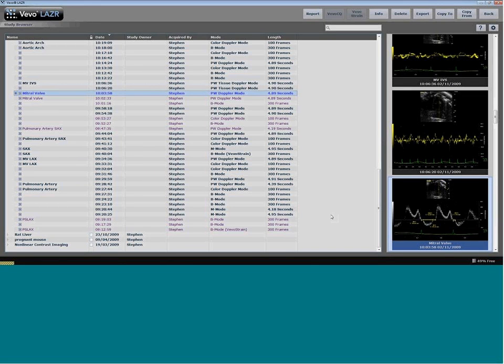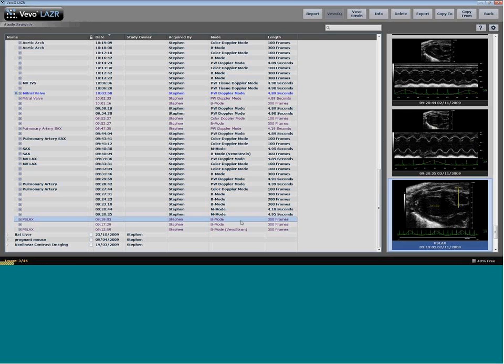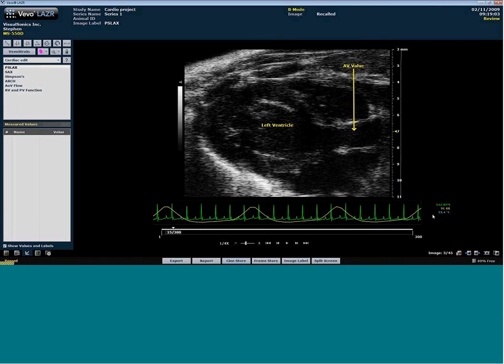So we've found, going around to all the different labs and different users and the work here, everybody has different approaches, but my personal preference is to try to keep the animals as light as possible. What I talked about earlier with looking at the heart rate and the temperature. So I prefer to keep the animals light, keep the heart rate up high, and again, just monitor the temperature with the heat lamp.